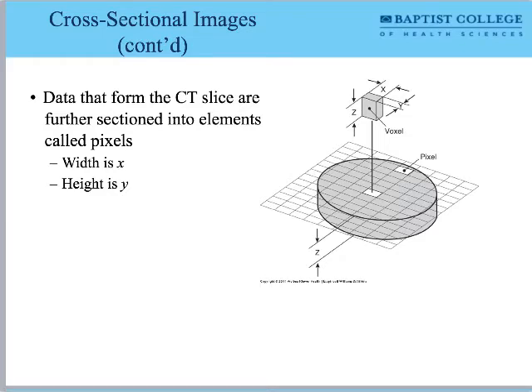The reason it does that is because that's the way computers think. So that's just how computers work. They need to store data somewhere. And so a matrix gives us a spatial way of storing data, to say that this is the way the data looks in space, inside the patient's body. I don't mean outer space, I mean in the volume of the patient's body. So it takes that information and drops it into different drawers.